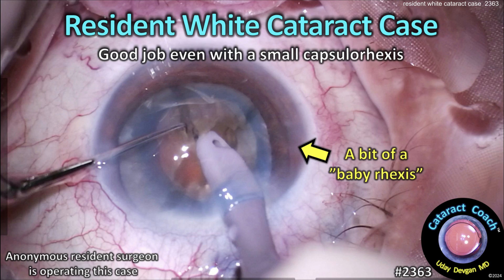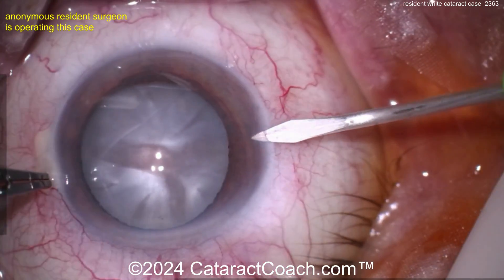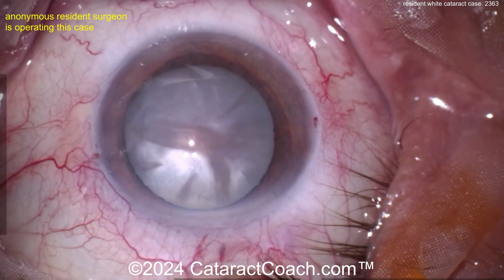Welcome to cataractcoach.com. This is a resident white cataract case — good job even with the small capsulorrhexis. We have an anonymous resident operating this case. We're going to speed the video up nice and fast so we can get through the whole thing. This is going to be shown at 4x normal speed. Now the first thing I notice is — what's up with that draping?